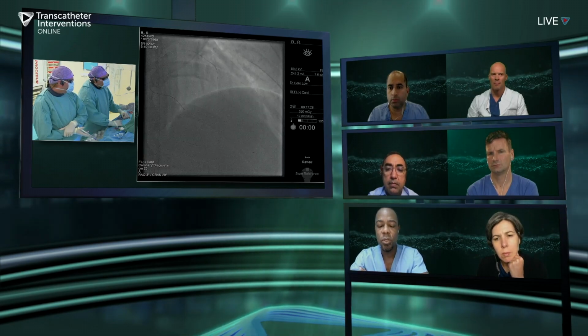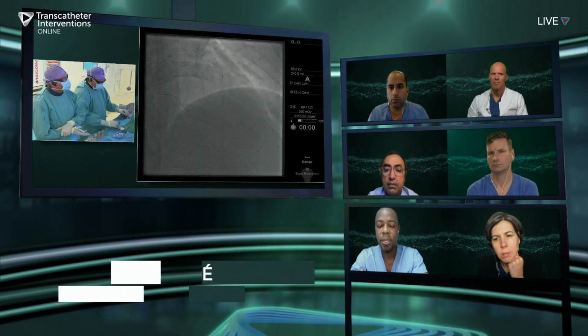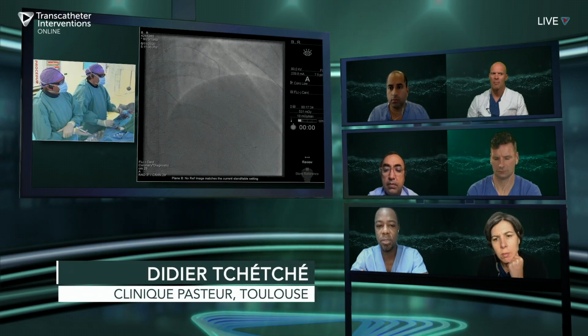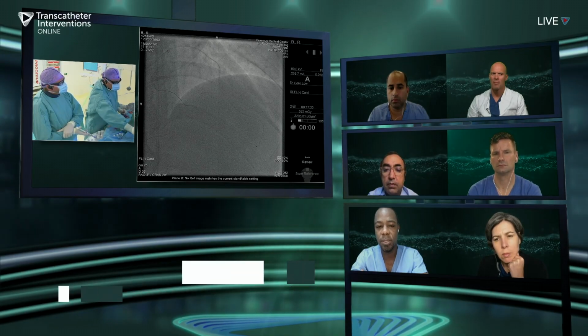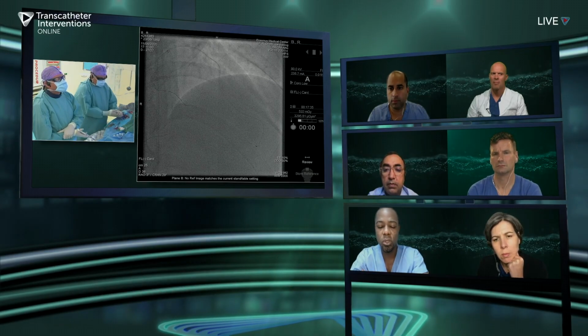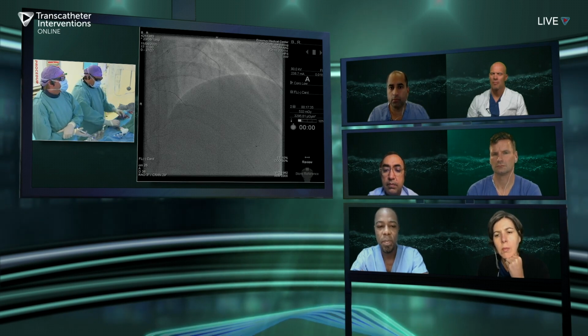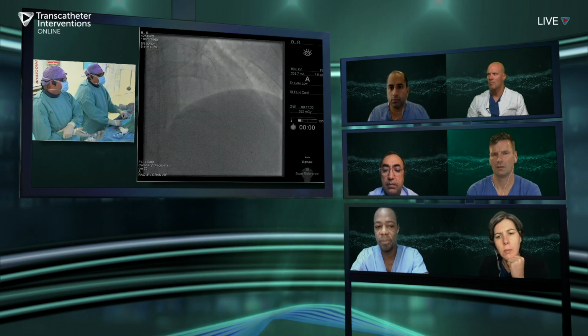Yeah, so my question was just for the audience, explaining the rationale of using a slightly stiffer microcatheter as compared to the Caravel that is regularly the first choice for such tortuous epicardial vessels. What are the advantages of the Mambaflex microcatheter?